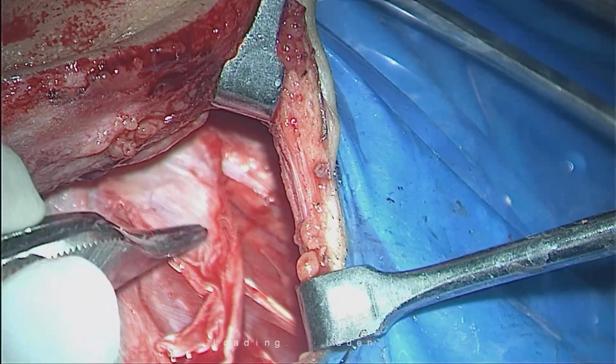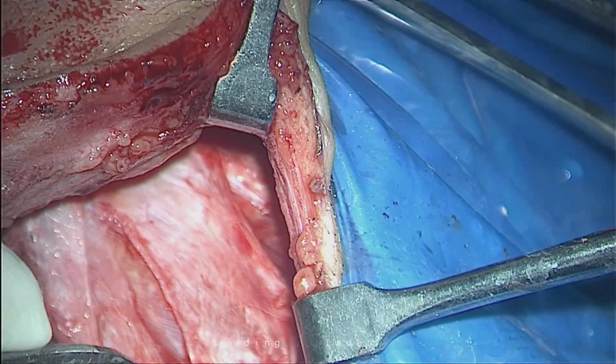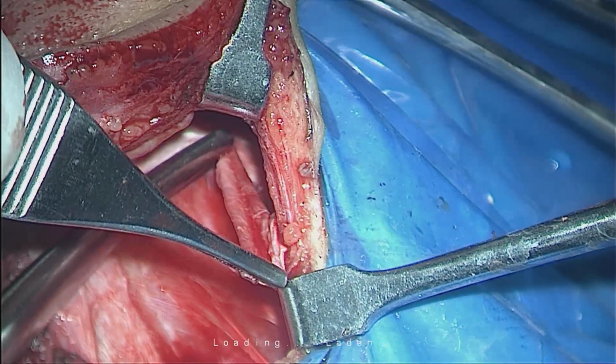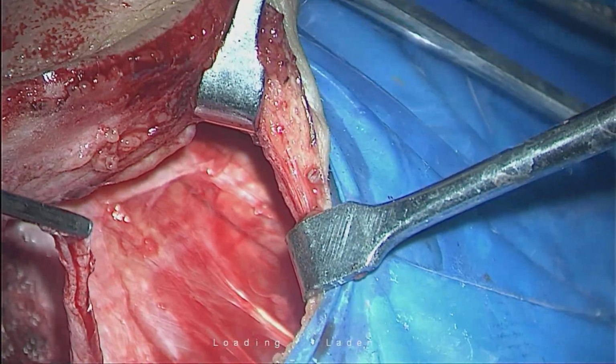So we should take a longer graft compared to a regular underlay case. No, not longer. The graft size is a little bigger, because this has to be on the canal wall all around the sides. Yes, sir. And we have to again pull it from there. I see the vessels inside the muscle.